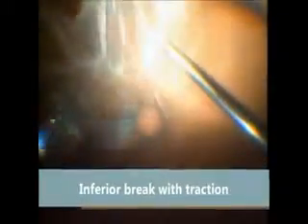Once again, a thorough vitrectomy is carried out. Membranes are removed under PFCL. However, the inferior retina remains stiff, and at this stage, a retinectomy is planned. Area of stiffness is assessed and a preparatory endodiathermy is carried out to reduce the risk of bleeding.